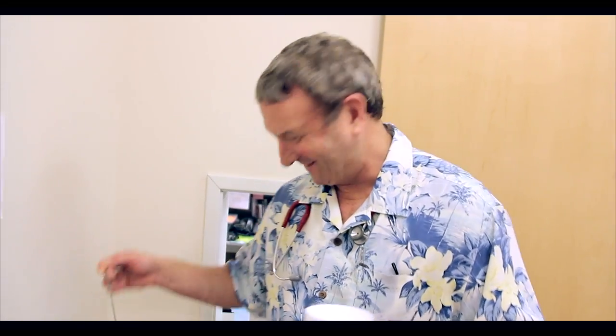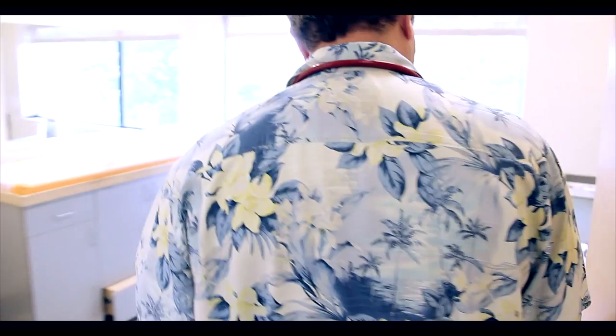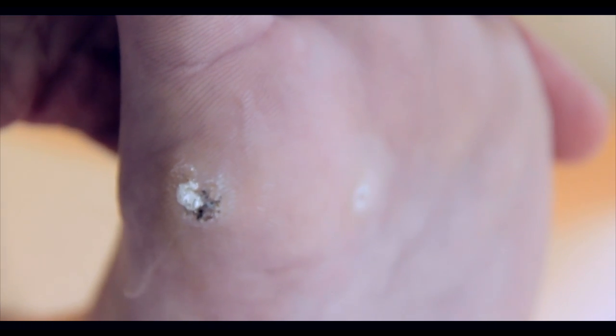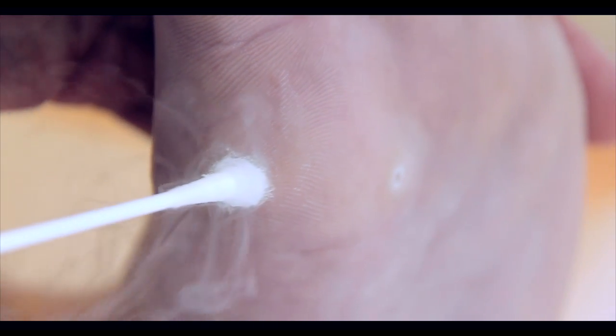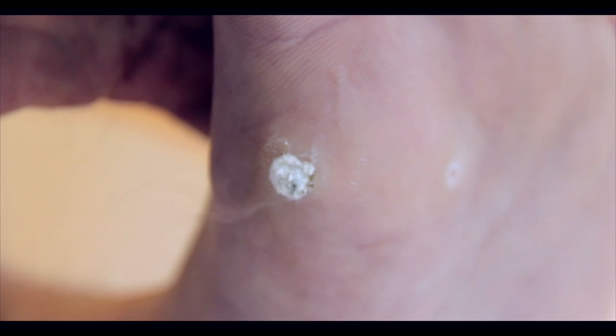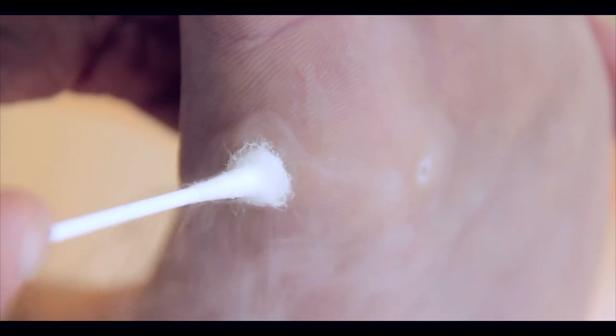We got the good stuff. Alrighty. You ready? We'll do this big guy first. So you're feeling it yet? Sorry, sir. Sorry to do a little bit. You can tell me if it gets really bad. If we can do a deeper freeze, it's a better chance you won't be coming back.